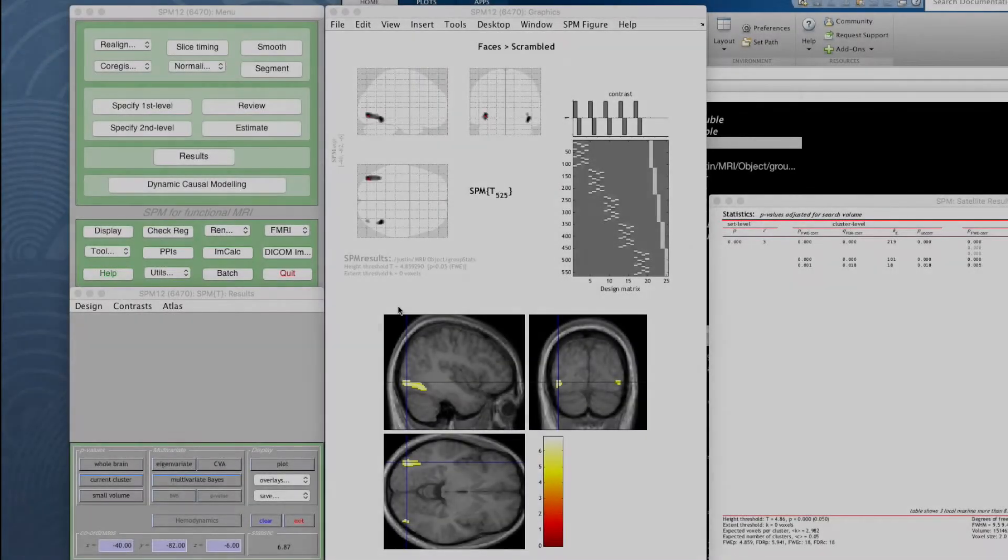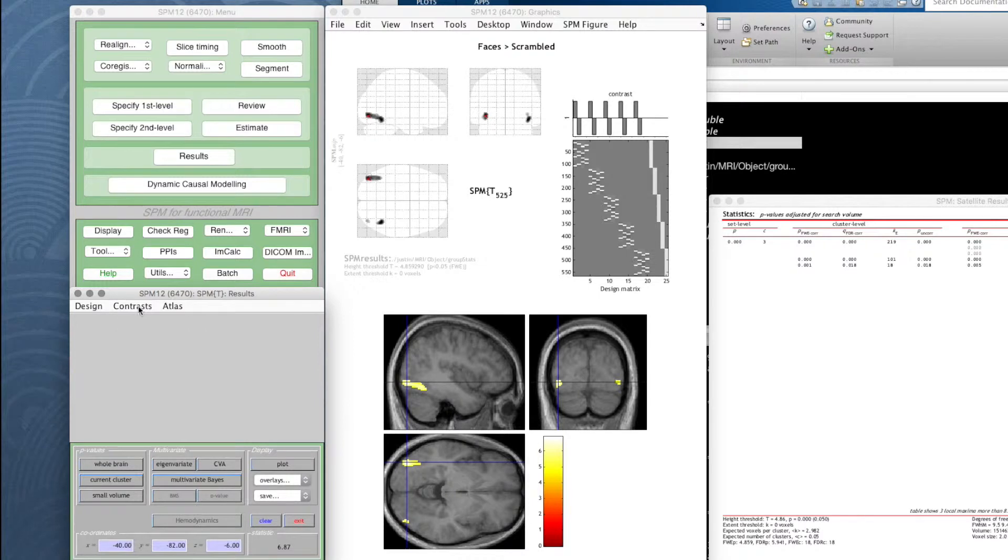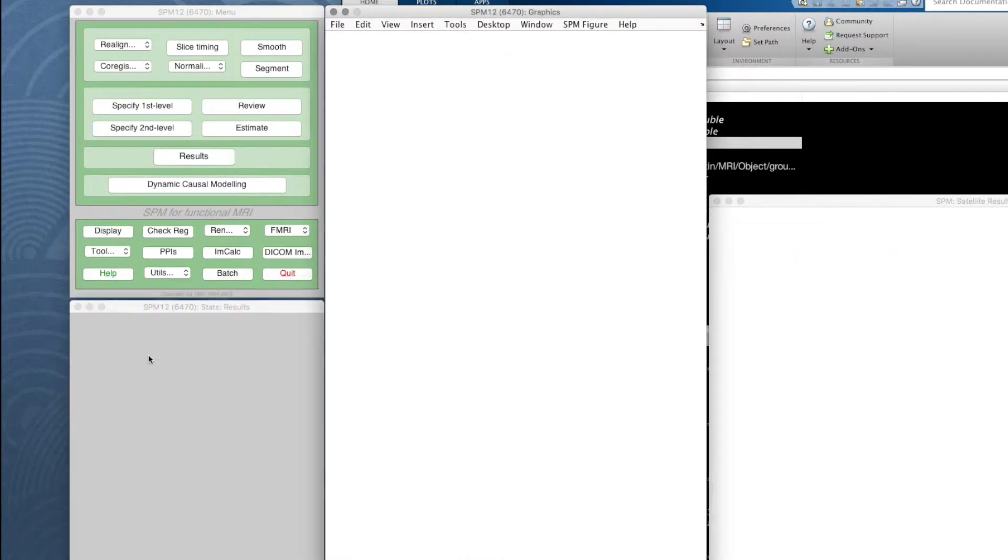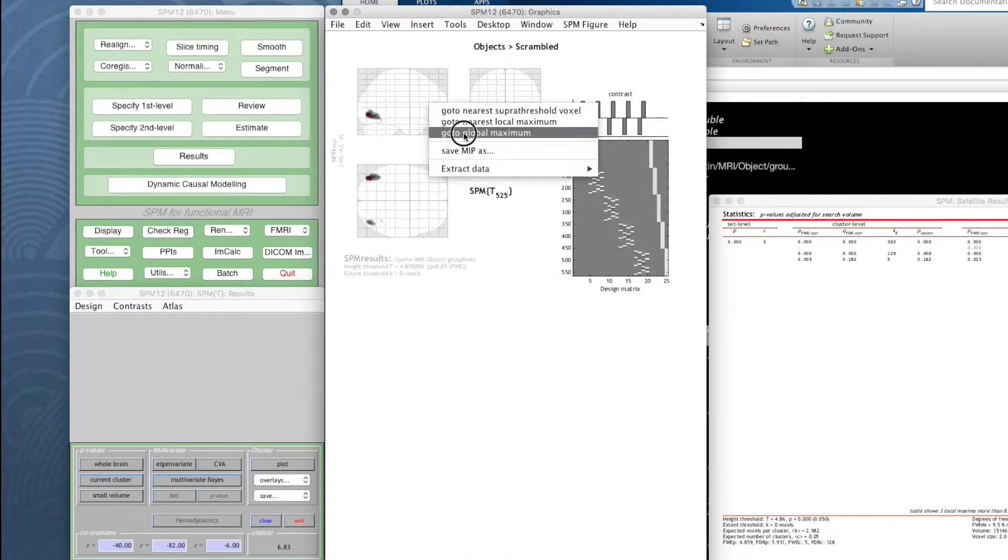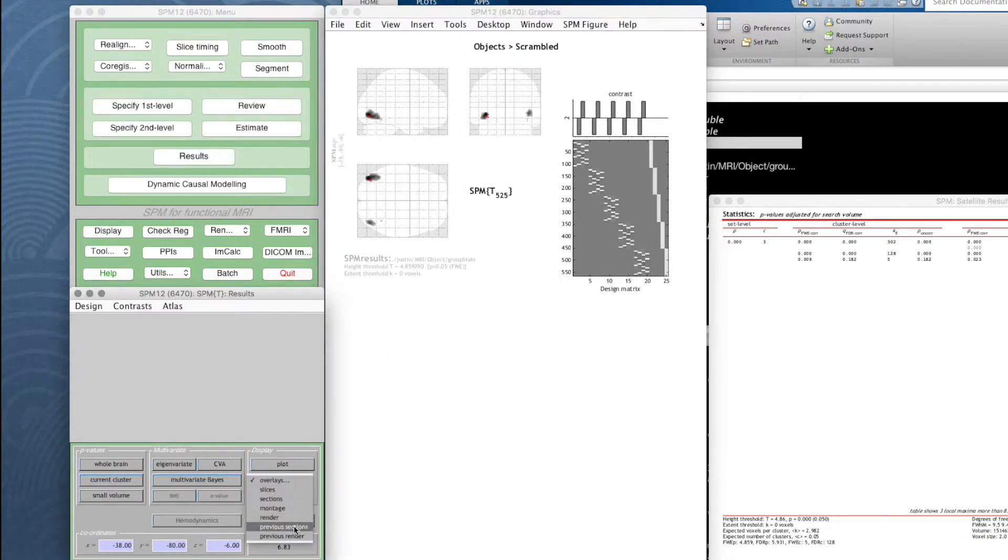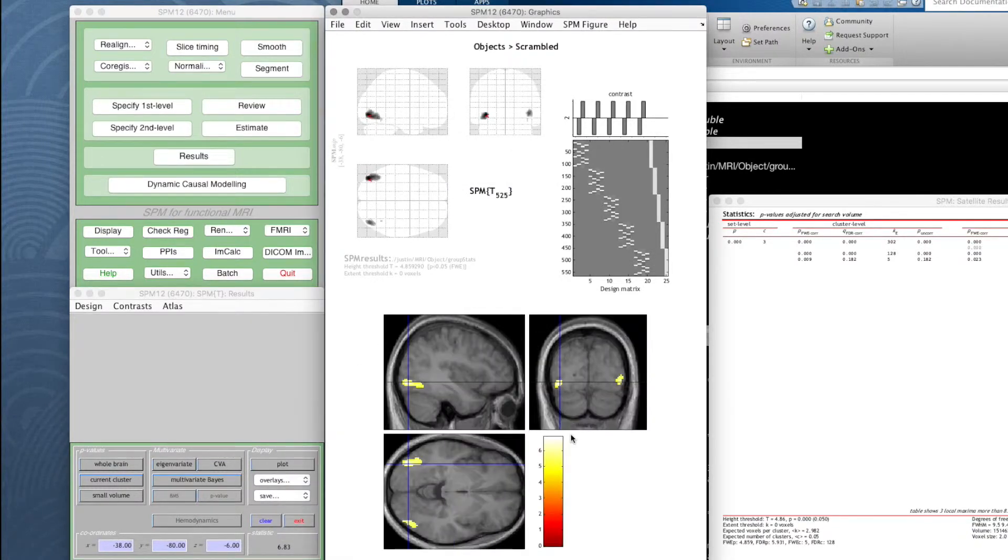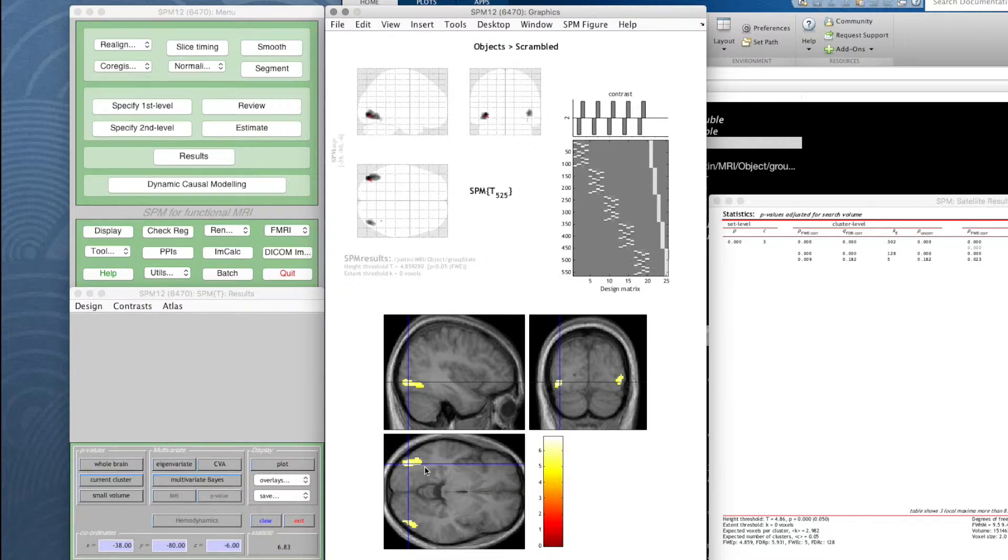We've been looking at our results and flicking between the contrasts we have just to see if we've got things going on in the same places. We've tried rendering onto a three-dimensional surface but what would be nice is just have a view like this with more than one blob on it, maybe the object data and the face data together.